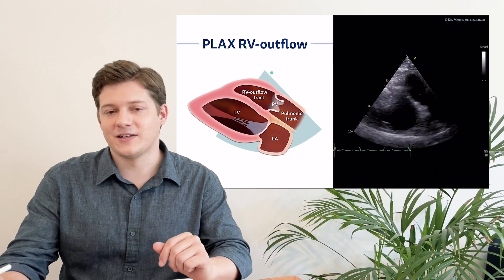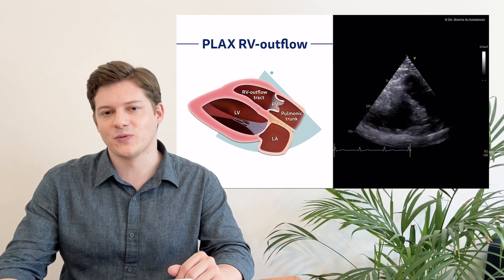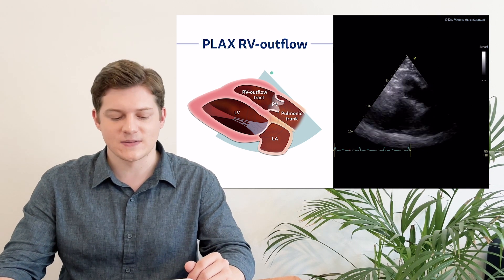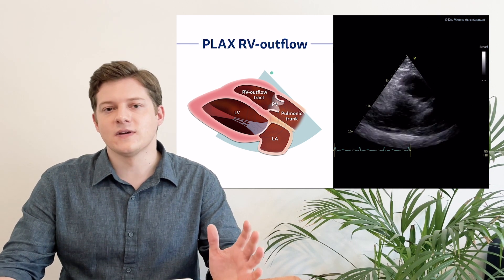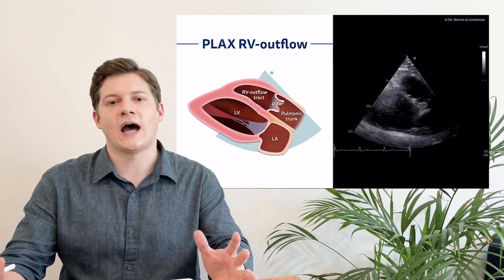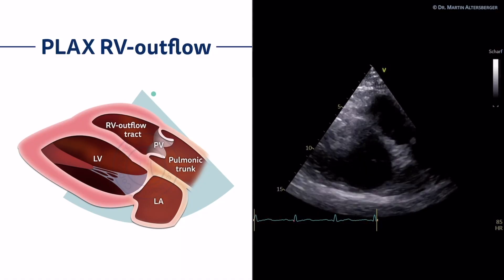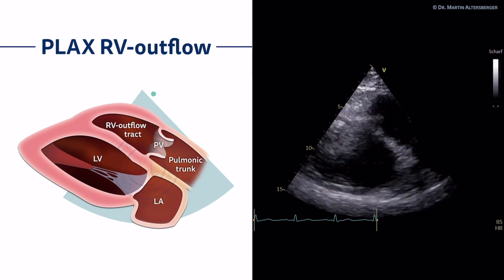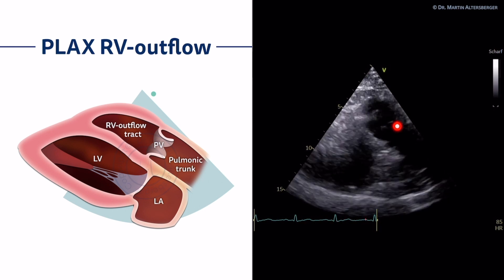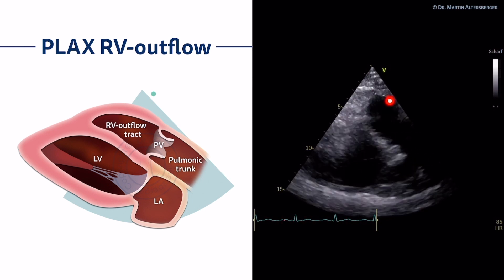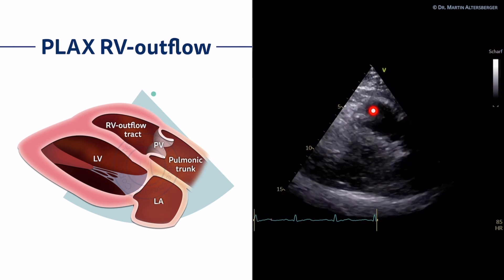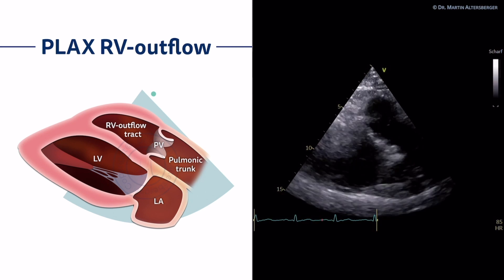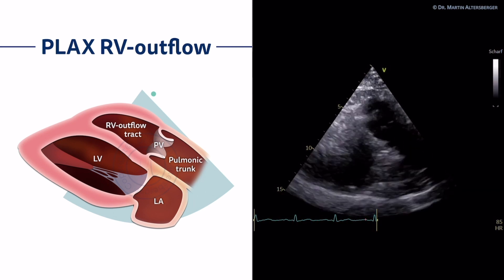The second atypical view of the long axis is the parasternal long axis right ventricular outflow view. I have to admit I do not perform it on a regular basis — only if I cannot perform it in a parasternal short axis. The outflow refers to the right ventricular outflow tract, the pulmonic valve, and the pulmonic trunk. You can see the right ventricular outflow tract and assess the motion and right ventricular function of the outflow tract, which also contributes to overall global right ventricular function.